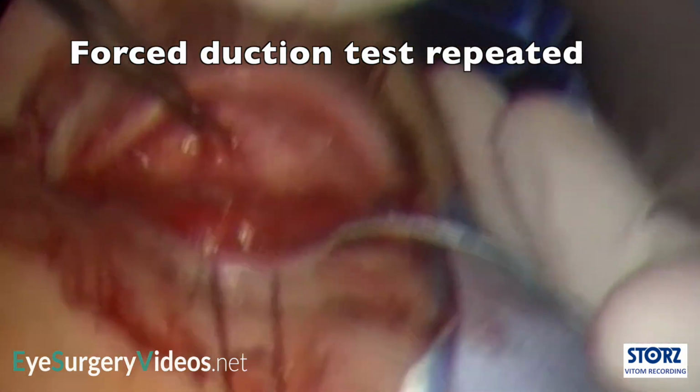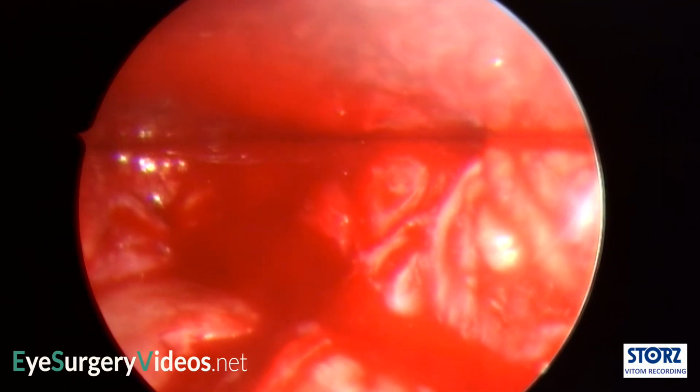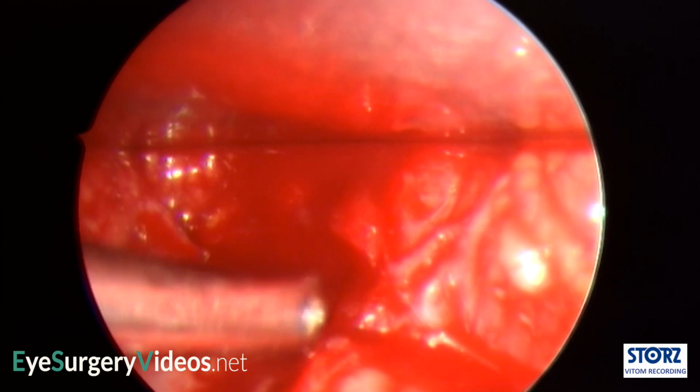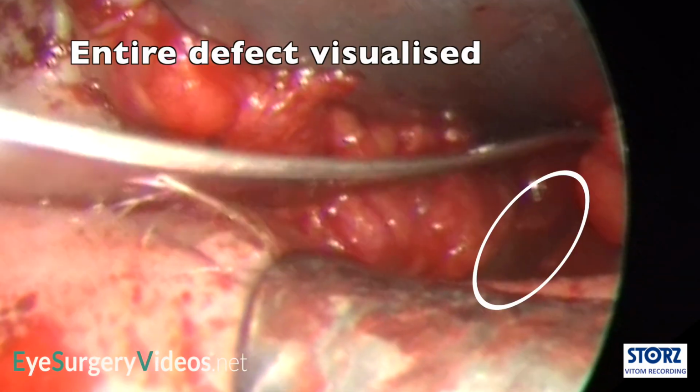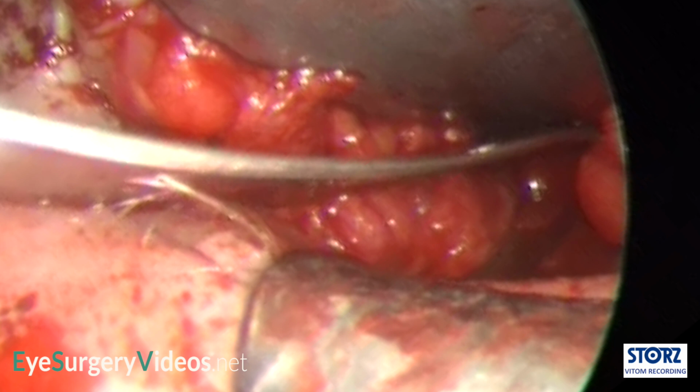A forced duction test is conducted on multiple occasions throughout the procedure to confirm the increasingly unimpeded motility of the globe as the tissues are released. Complete release of herniated tissue is confirmed when bone is seen throughout the periphery of the defect. It is particularly important to assess and confirm an adequate posterior edge, as the implant will rest on this, and if it is not present or adequately exposed, the implant will either not be stable or will be pushed forward.